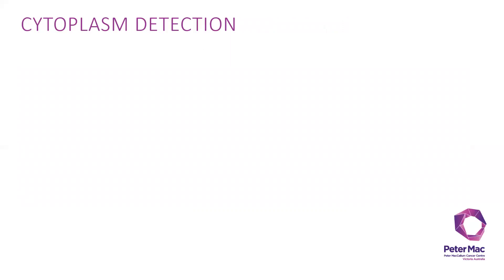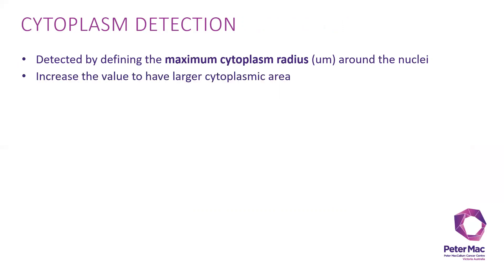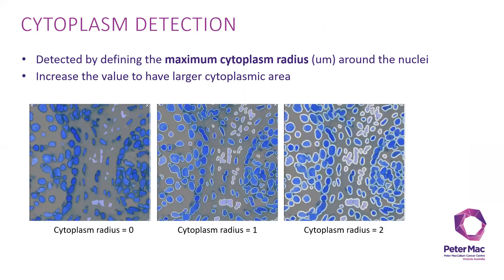After that, you do the cytoplasmic detection, which is done by defining the maximum radius of cytoplasm around the nuclei. You can increase the value to have a larger cytoplasmic area. In the picture here, the leftmost doesn't have any cytoplasmic radius, then one micron is the usual default size of cytoplasmic radius with the white halo around the cell. You can increase it to see a bigger halo around the cell.